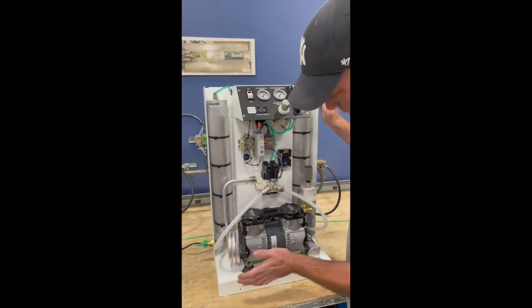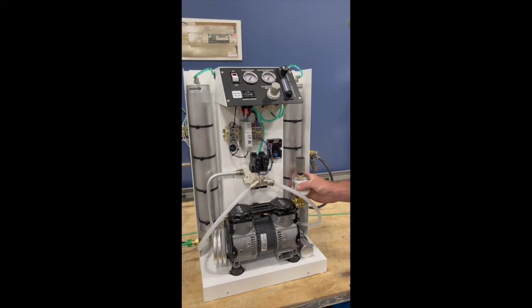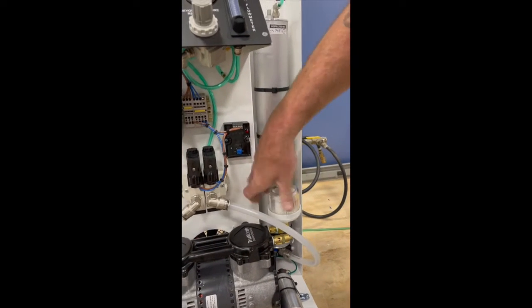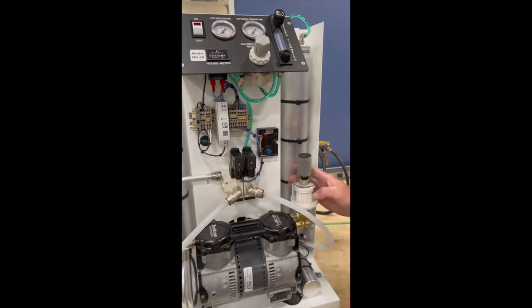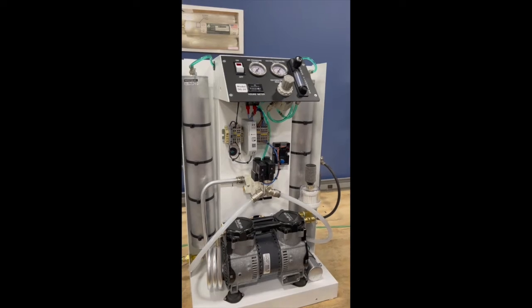This is a cooling tube that keeps everything cool. These are your two filters that you change every six months. Pretty simple, not hard to change — you take them off, put your new ones on hand tight, and you're good to go for six more months.